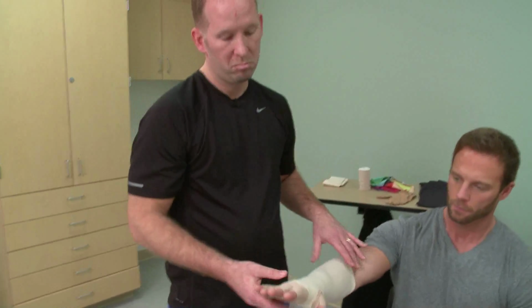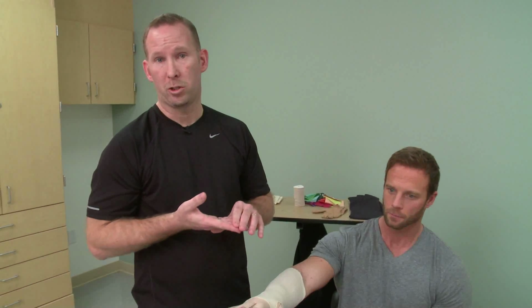This will be worn full-time. Full-time usually means about 23 hours a day. That allows the patient to have it off for the 1 hour per day for bathing, dressing, lotioning, and skin inspection.